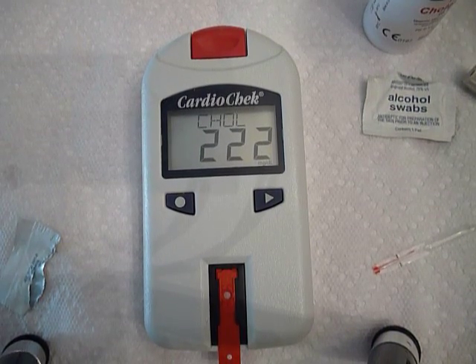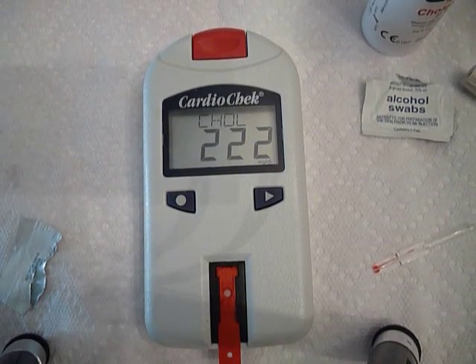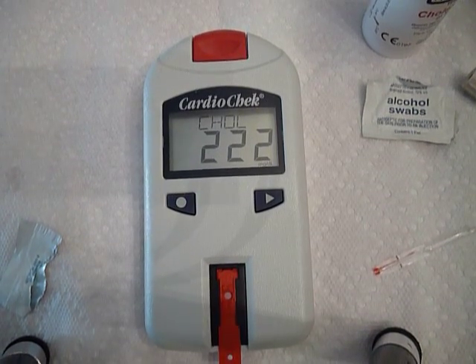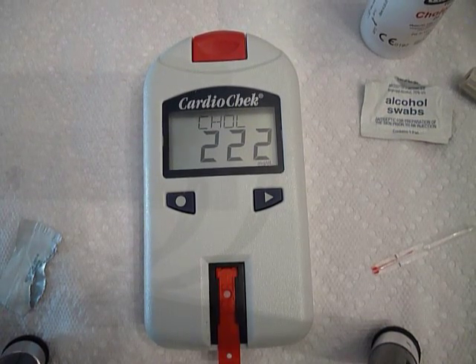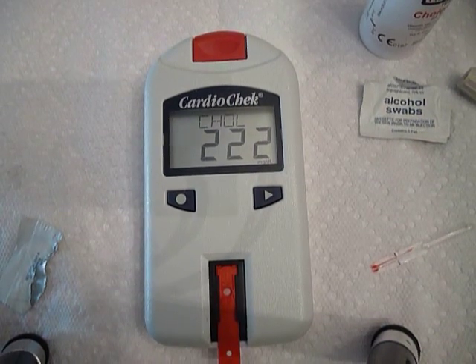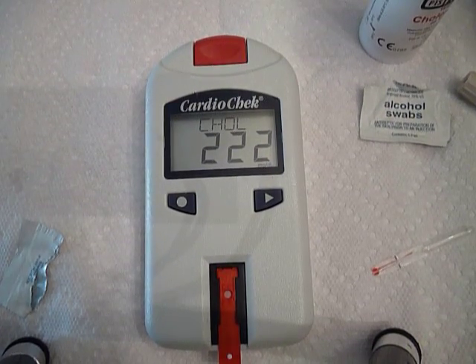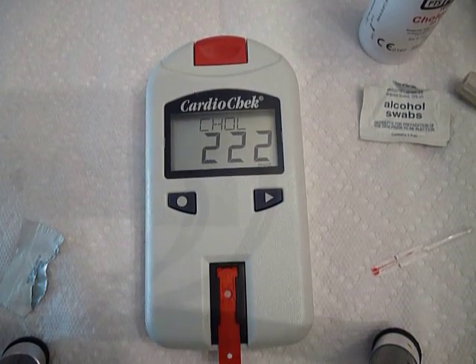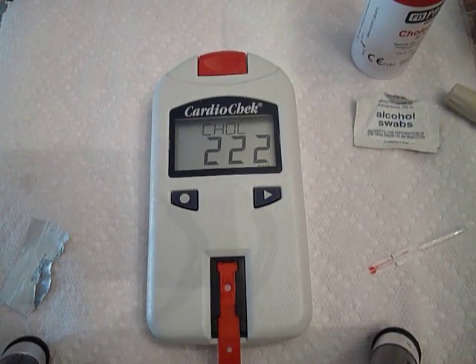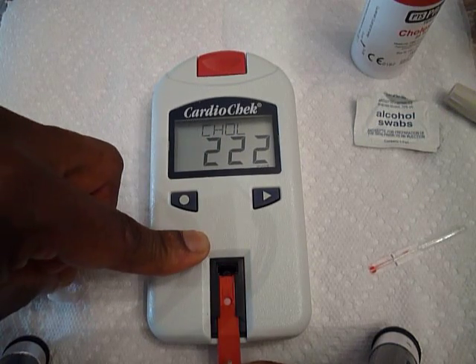222 — that's a little high. It should be under 200. I hate to make excuses but it is the Christmas season. I have been drinking a lot of eggnog without alcohol, and the fat — and of course those chocolate-covered cherries with the clear liquid, I love those. Chocolate, eggnog, and dairy products will drive your cholesterol through the roof. Over the next couple of days as I scale back, it should drop.